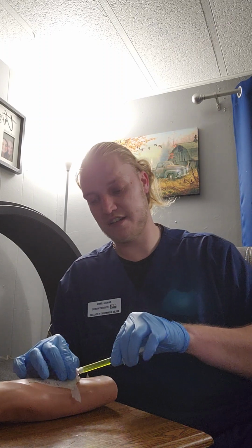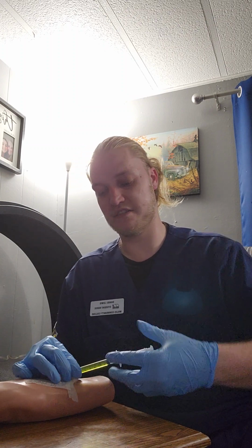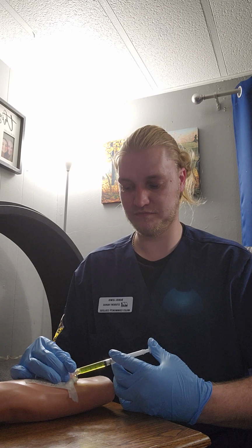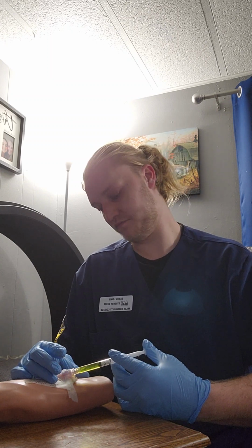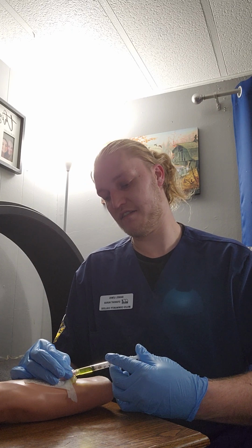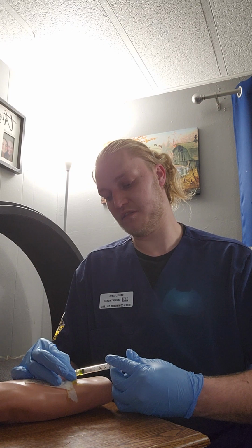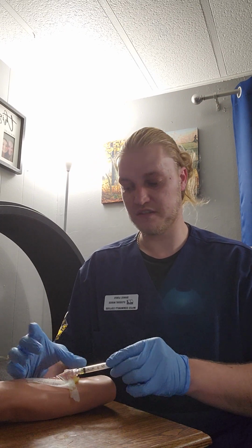Had a brain fart there for a minute. So I'm going to go ahead and attach the syringe. And again, I would be doing this at 1 milligram per 2 minutes time.